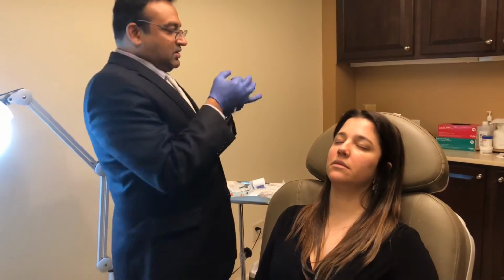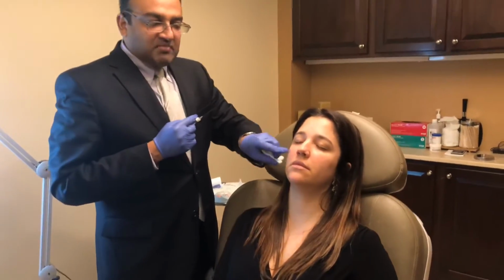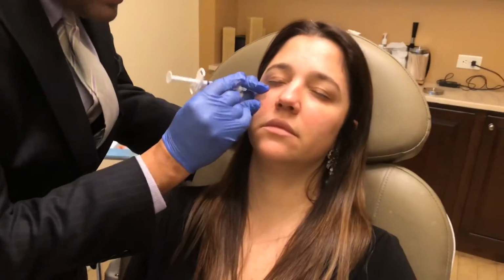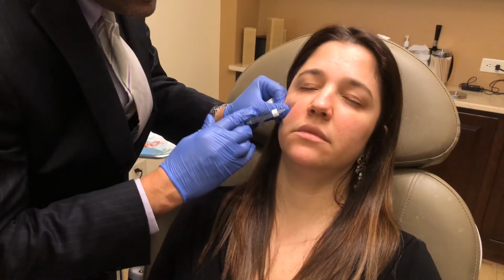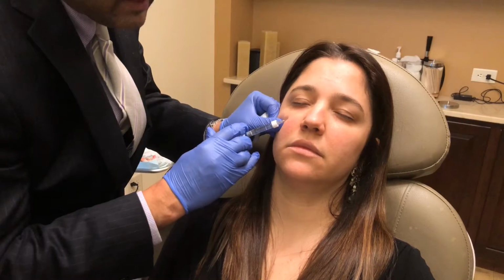So this is my product with the cannula. The tip itself is actually blunt, it's not sharp, and that's why we made that original hole, because we're going to try to find that hole. It is rather tiny. And we're going to try to get it into the same place, and a little bit of pressure, my dear. And now we're in. You're doing fabulous. You're going to feel a little bit of pressure.